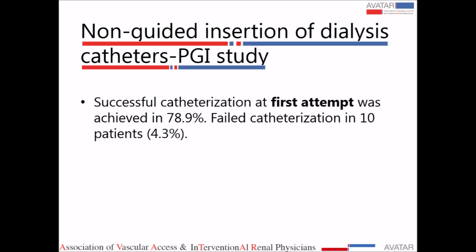The insertion complications were noted in 12.8% of cases, out of which traumatic complications were around 10.7%, and arterial puncture was 5.2%. Now, what is recommended with the use of ultrasound guidance is that your arterial puncture rate should be around 2 to 4% or less, as low as possible, and the traumatic complication rate should not be more than 5% or 7%. We had noted more traumatic complications, more arterial puncture, hematoma in around 3%, malposition, and all sorts of complications which have been reported.